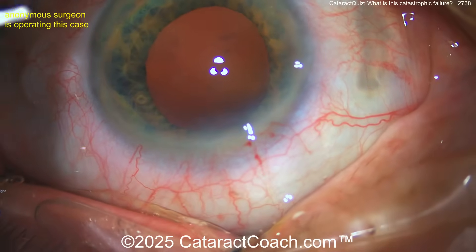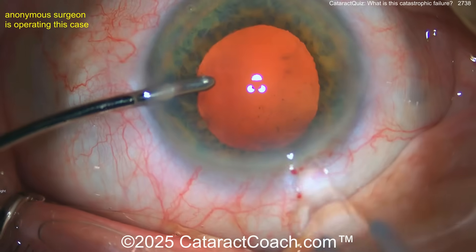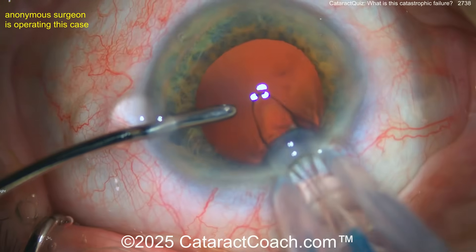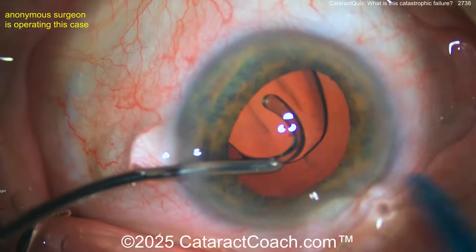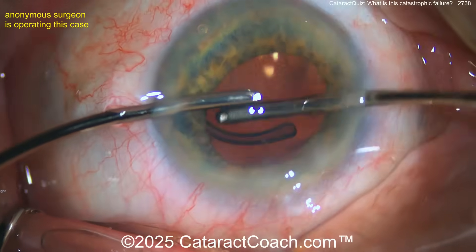Keep watching — inserting the lens. The eye is full of viscoelastic. Look at that Descemet's tag right at the left side of the incision. Here comes the injector. Injector looks pretty good — deliver the lens, looks like a single-piece acrylic, going into the eye nicely. Bimanual I/A to get it in the capsular bag.